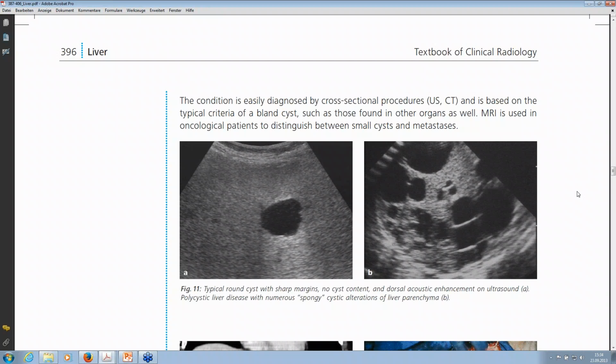But as I remember in such cases, very often you rely more on the remembrance you have from former cases if you do not succeed in a direct comparison within that patient. This is not really a big problem, because the echogenicity of the liver is not a quantitative analysis.